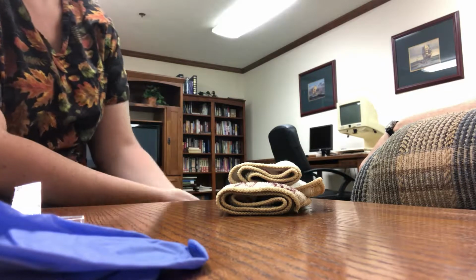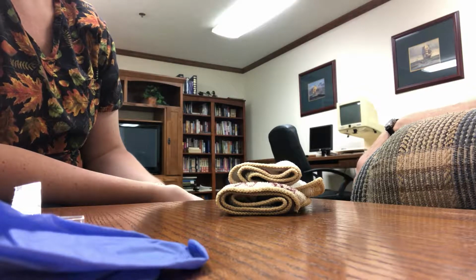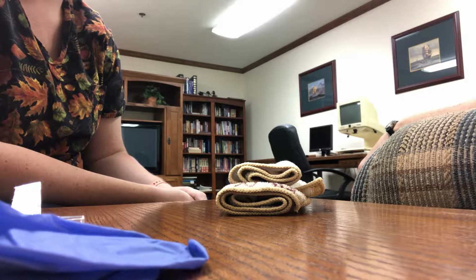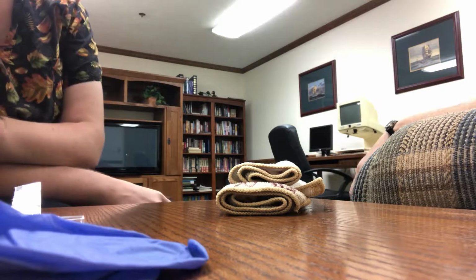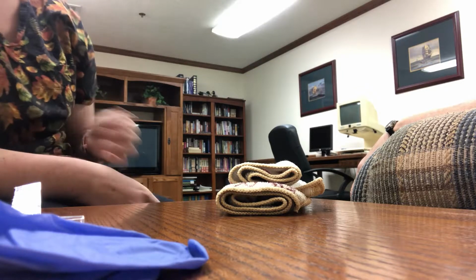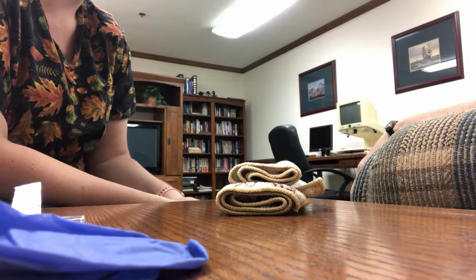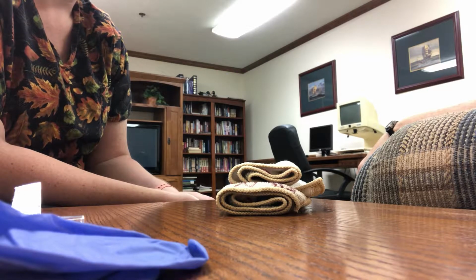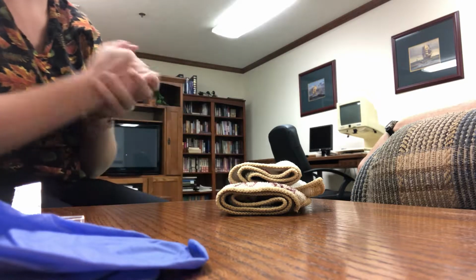Okay. Can I have you verify your full name and birth date for me, please? Cheryl Lynn Robinette, 11/1/52. Okay. I just want to check your chart, Cheryl, to make sure I don't miss anything important. Okay, and we're going to go ahead and get a quick set of vitals. I'll get your pulse, your respiratory rate, your heart rate, and your temperature. Get a blood pressure too. And I'll go ahead and wash my hands.